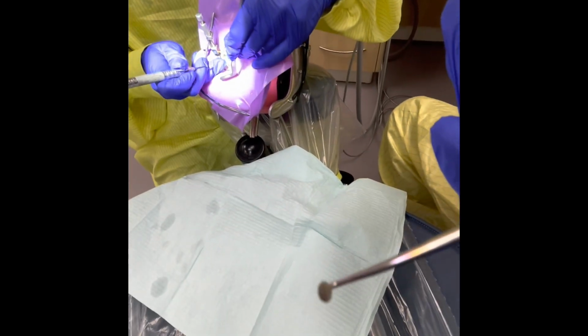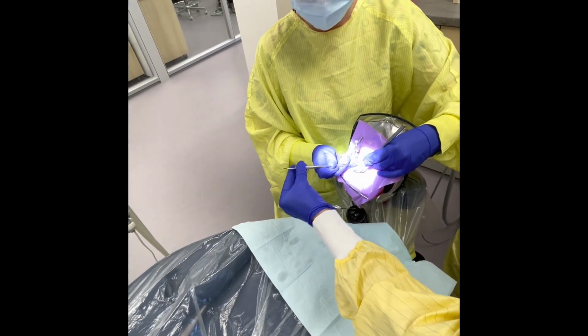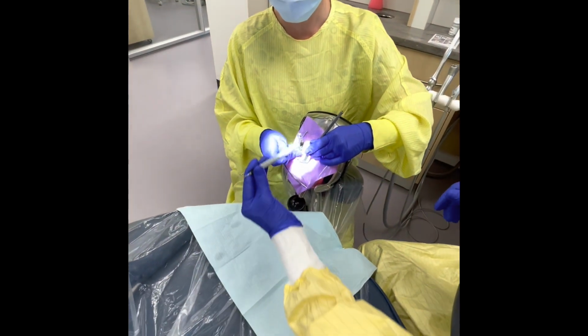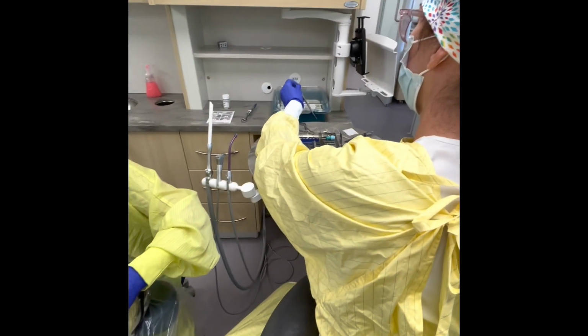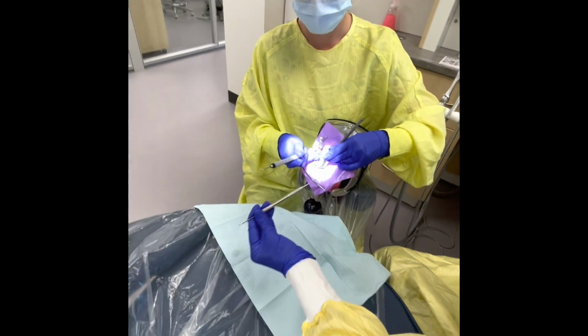It's just a little round one. I'm going to pass that to Amanda. She's going to do some carving. She's going to put some anatomy into her filling. Okay, and I will take the Hollenback instrument, please, Stacy. Thank you. All right, and I will take the opposite end of that as well. Again, I'm going to flip this over top of my cassette and then come back into the transfer zone.